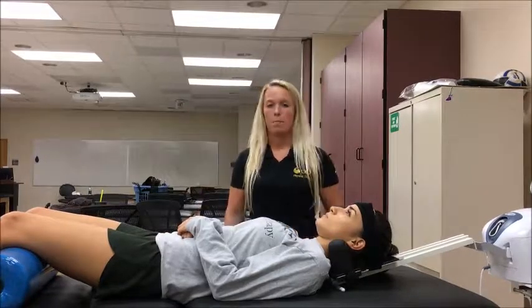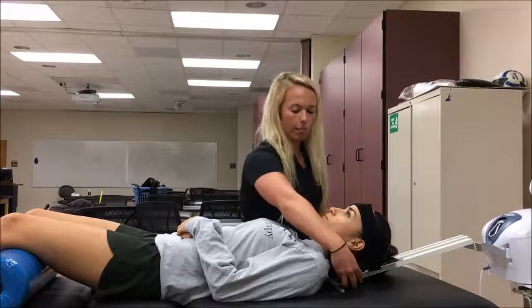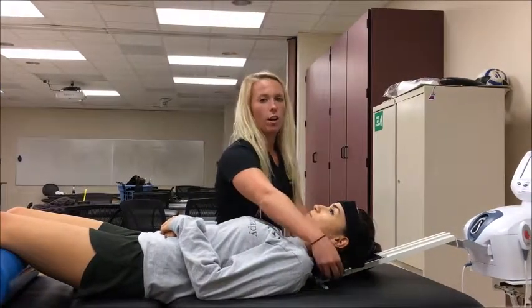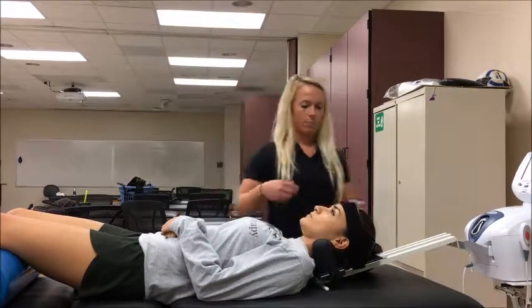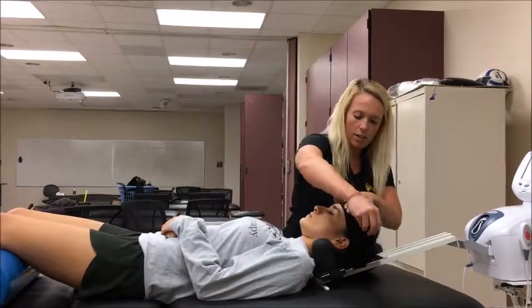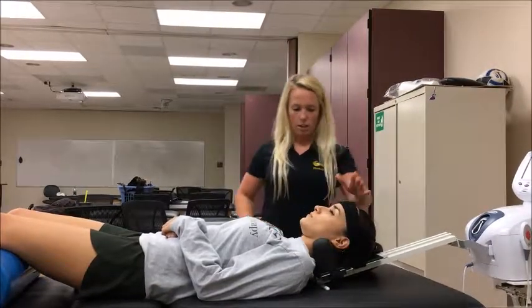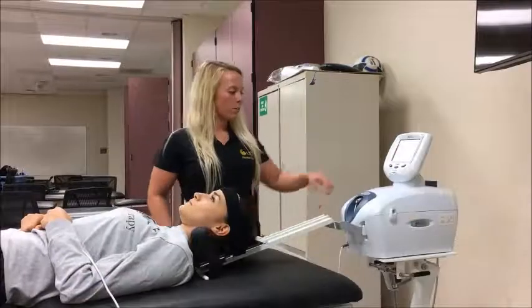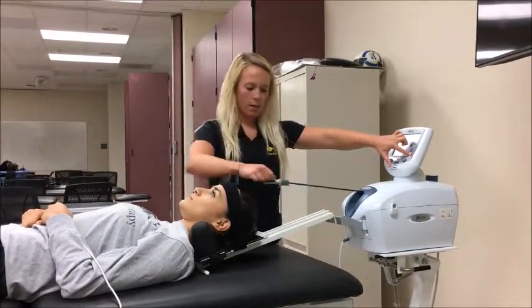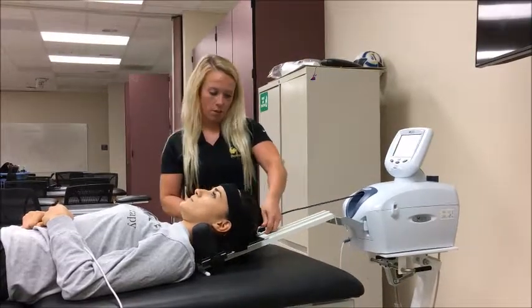lower cervical spine musculature. Then you want to use the knobs here to make sure that the neck wedges are snug against the occiput. Also, we're going to make sure that the forehead strap is snug against the forehead. Are you comfortable? Next, we need to release the rope by holding down the rope release button and pulling on the rope. Then attach it to the metal piece on the halter.